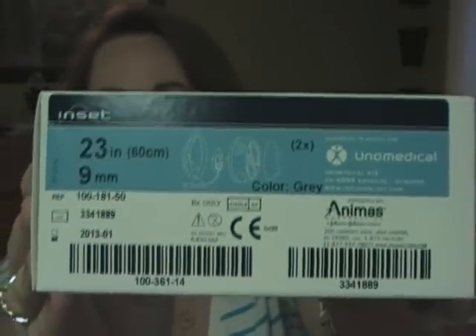Hey y'all, it's Sarah, and I've got my box in today. It's the Animus sample pack.